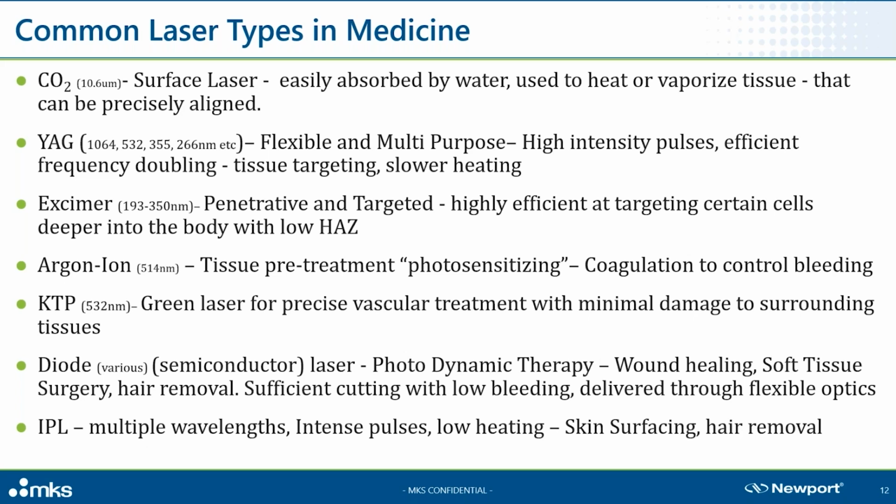We have the argon ion gas laser. It is blue-green at 514 and used in a lot of medical applications due to high beam quality. But due to low efficiency, other lasers are beating it out in select applications. It's still used in photodynamic therapy and other endoscopic procedures for examination and treatment of internal organs because it can be delivered easily through a flexible tube.